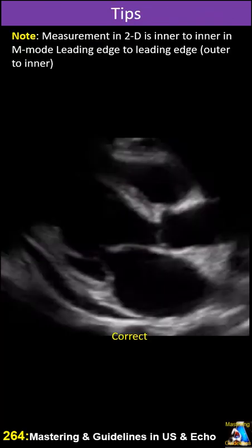For measuring the LAAP dimension, we have to follow the same rule and concept that I mentioned for the left ventricle dimensions. Our measurement should be perpendicular to the left atrial long axis on this view. On PLAX, for example, here, this will be our left atrial long axis. So our measurement will be this way.